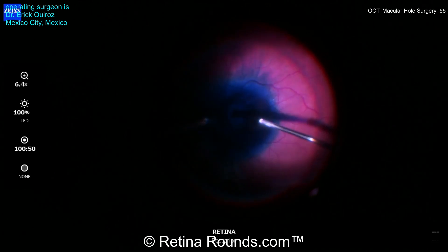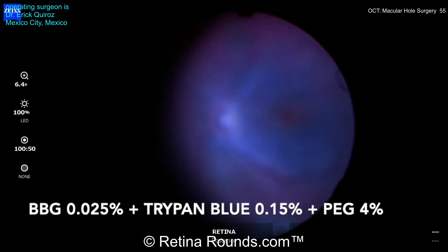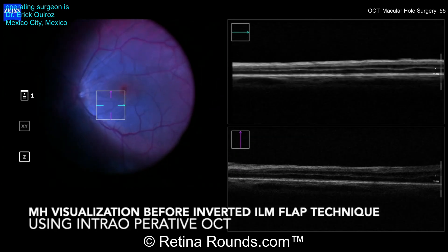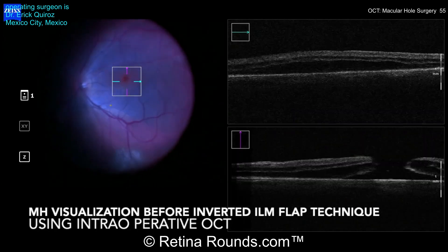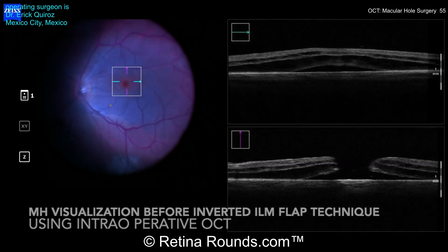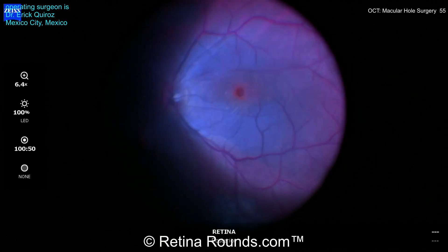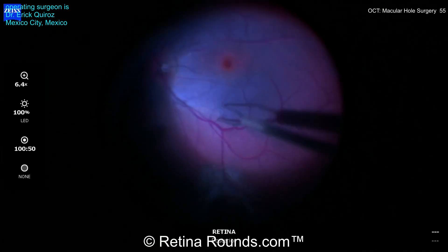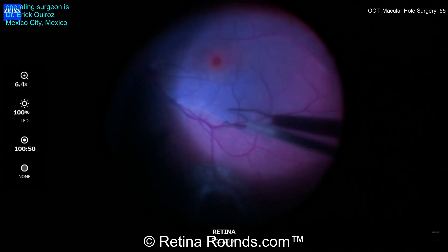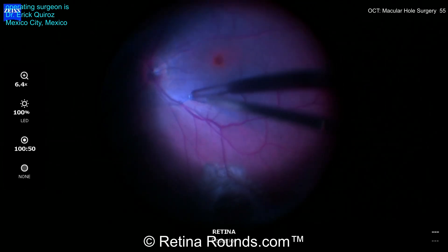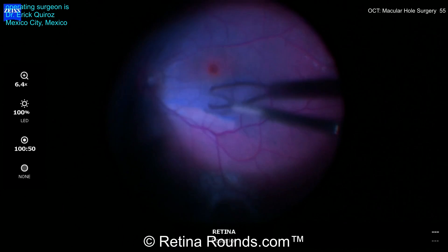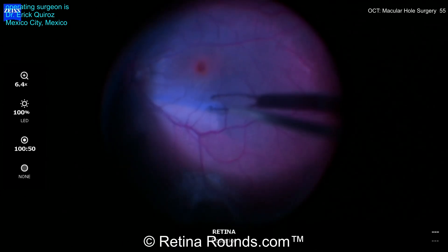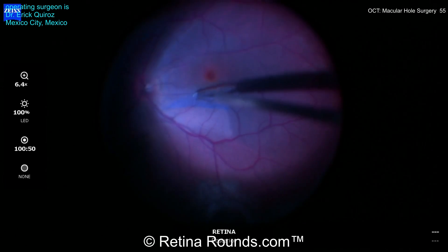At this point in the surgery, Dr. Quiroz has already performed the core vitrectomy and peripheral shave, and you can see that he's using brilliant blue dye, or tissue blue, to stain the ILM. Now he's using the intraoperative OCT to visualize the macular hole, and using a pinch-and-peel technique with ILM forceps, the superior edge of the ILM is being elevated. You can see that he's being very gentle not to create any iatrogenic trauma to the underlying retina.